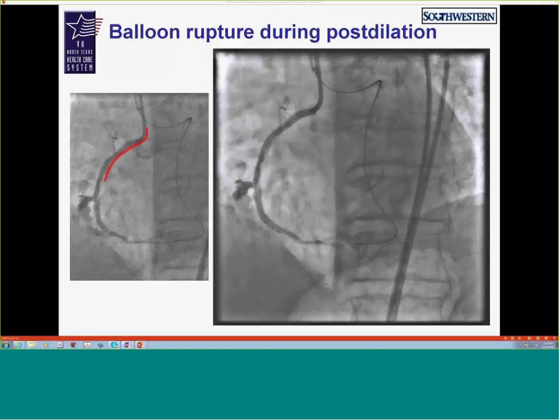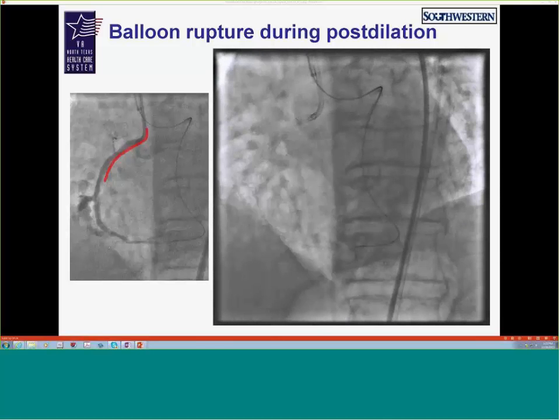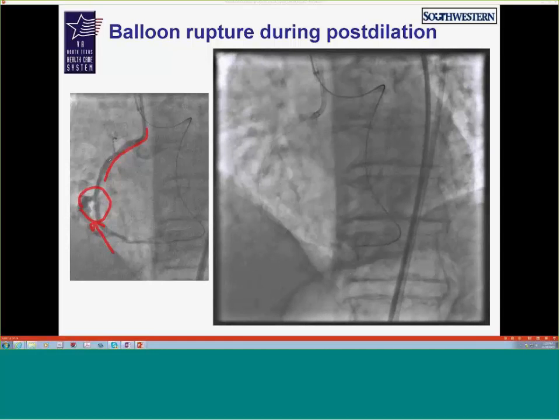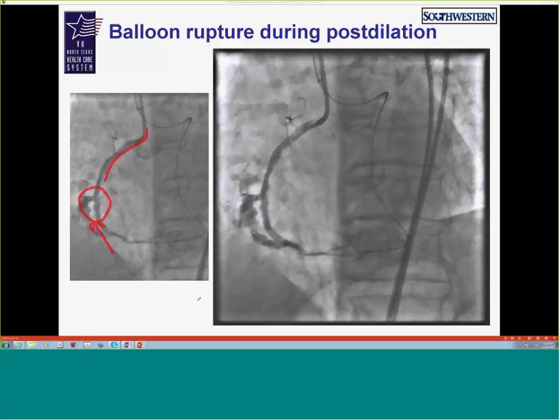Actually, one thought that came from a colleague is, retrospectively, put a balloon retrograde and tamponade retrograde, and then get a wire through antegrade and deliver the covered stent that way. Yeah, that would make sense also. That would be a good way to do it also.